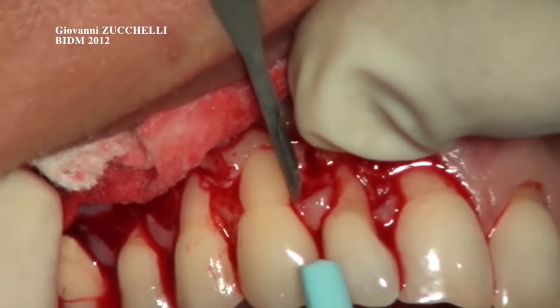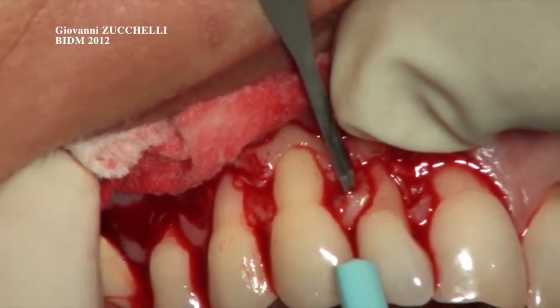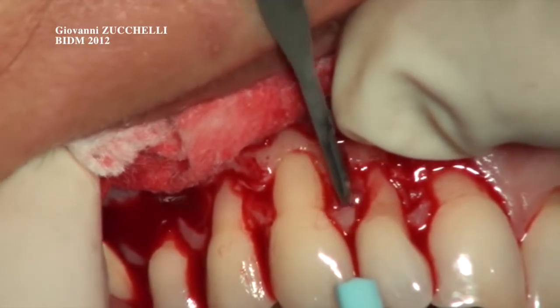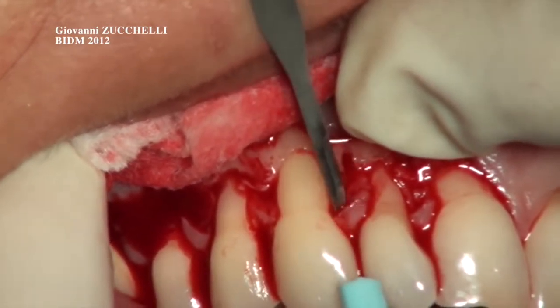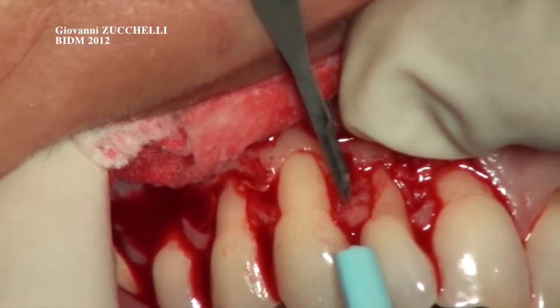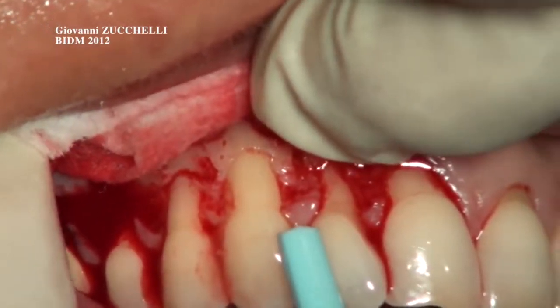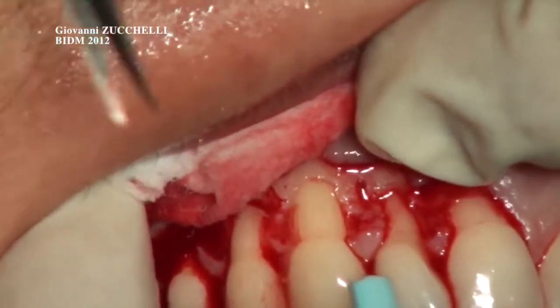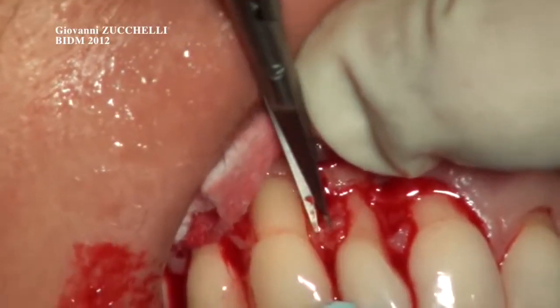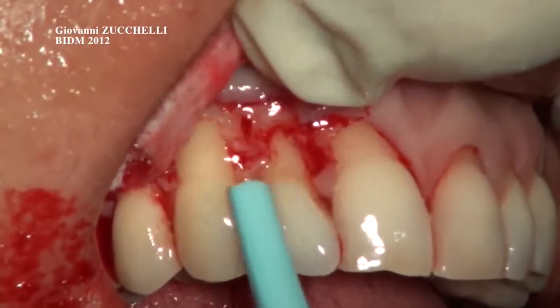Very carefully, only the epithelium is elevated. Now it's turning over due to the presence of the suction here. Please, suction. May I have some saline too here? May I have another one? And then the epithelium is completely removed.